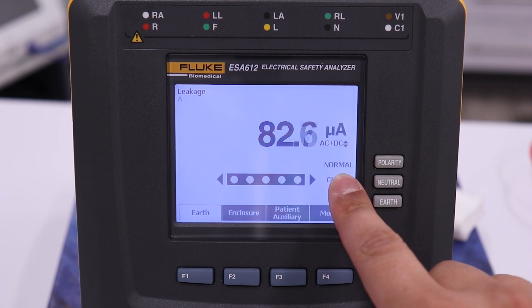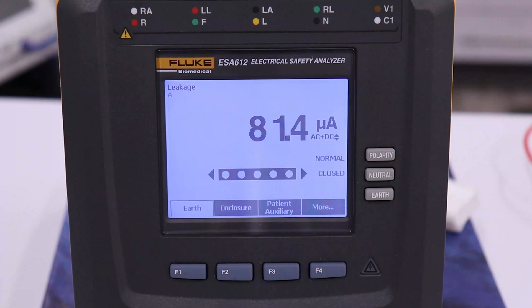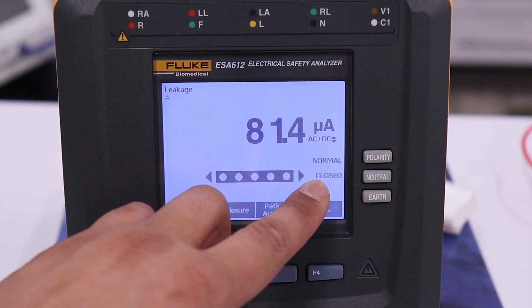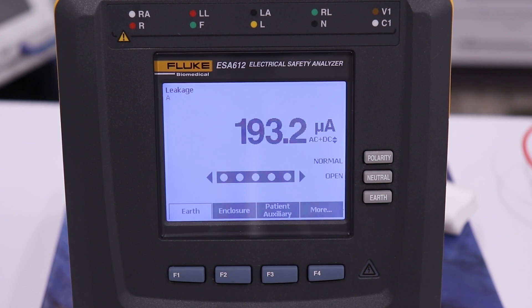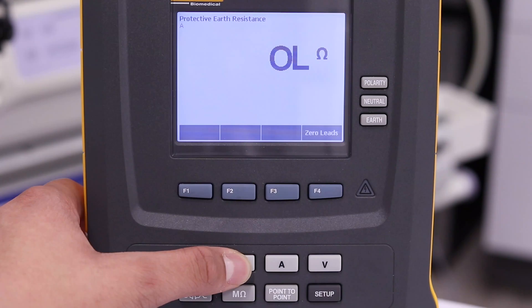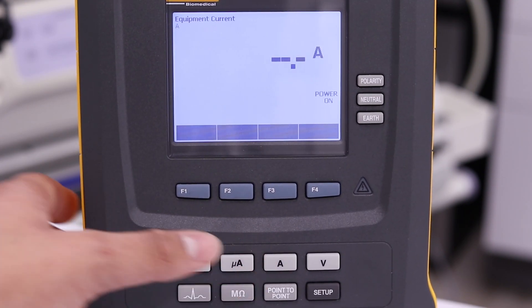Select normal polarity and close neutral. The GI-4000 will remain on in normal condition. To measure single fault condition, open the neutral line by pressing the neutral button. The GI-4000 will turn off in single fault condition — do not be alarmed. The GI-4000 can be turned back on by pressing the A button on the ESA or by closing the neutral line.